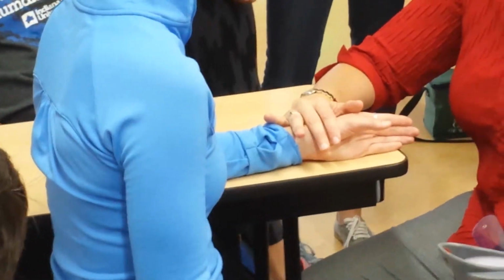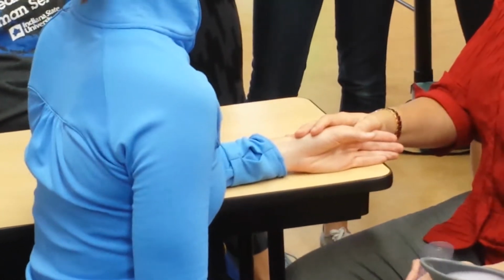Can I show you flexion and extension of the CMC, or do you want to measure this one first? Question. Yes. So for documenting that, would you start it at 20 or would you start it at 0? No, you would call it, so thank you. So you are going to document it from 0 to whatever her excursion was. So for her, I would document 0 to 10, even though it went from 20 to 30, I would document 0 to 10. Okay? In abduction. Yeah.